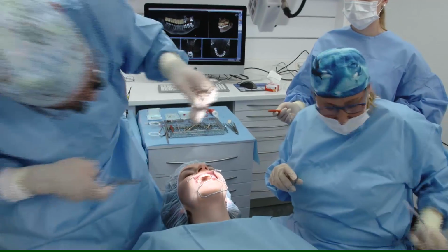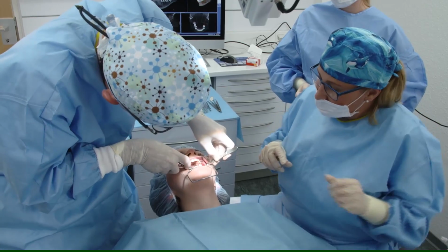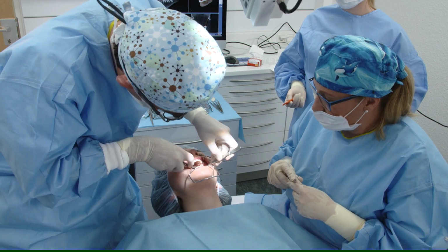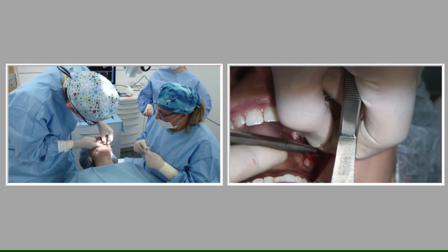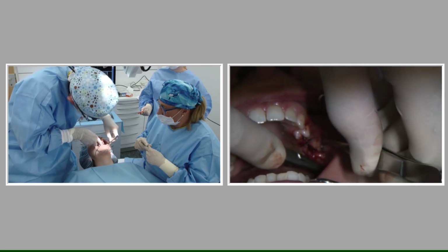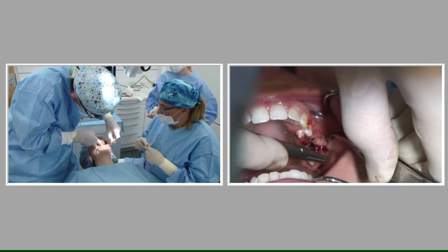Do another scan with the Omnicam and place a provisional crown on it for immediate loading. But anyway, with a reduced height of the crowns. No full loading, only no contact.